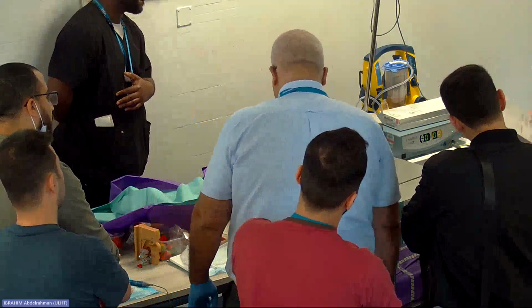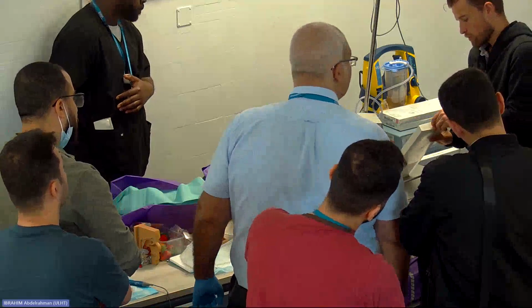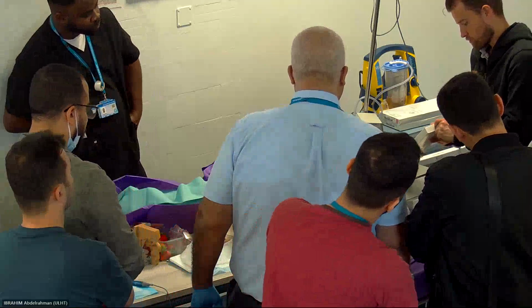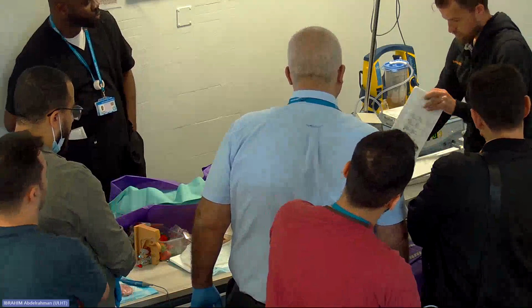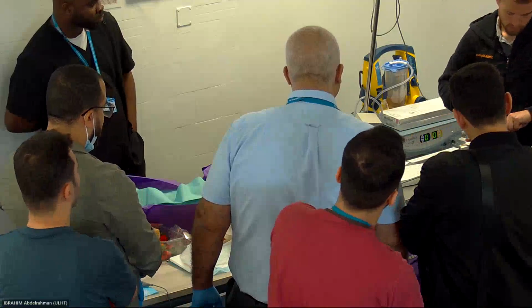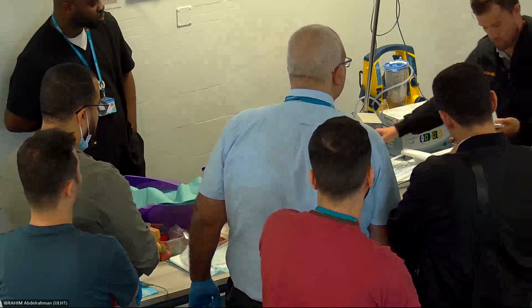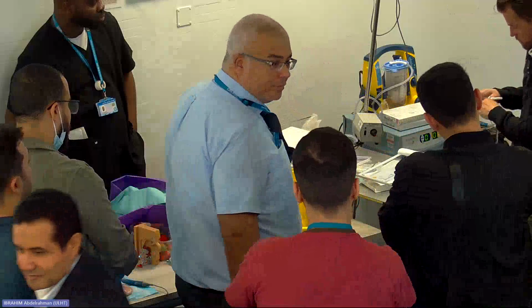So the only thing you need to do is plug in the wand, which will be set up for you. There is something I want to show you, because typically this is what goes wrong. The tonsil wand: when you open it, there are essentially three things you need to do.